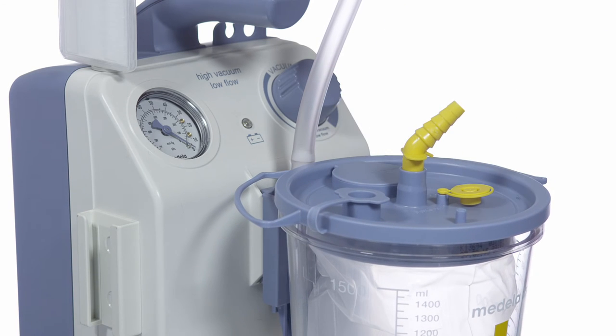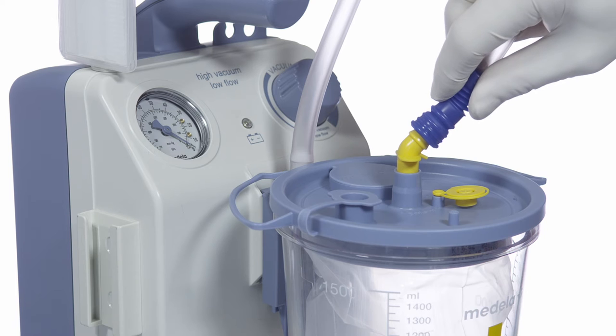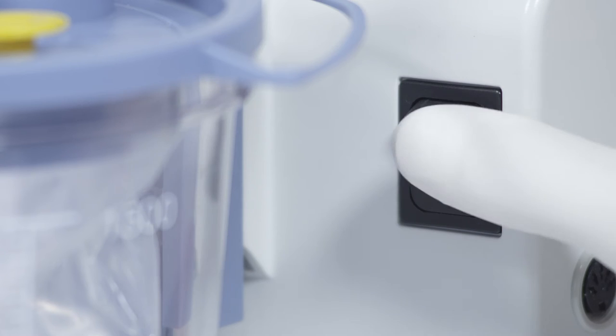Attach the patient tubing to the lid of the jar. Switch the device on.